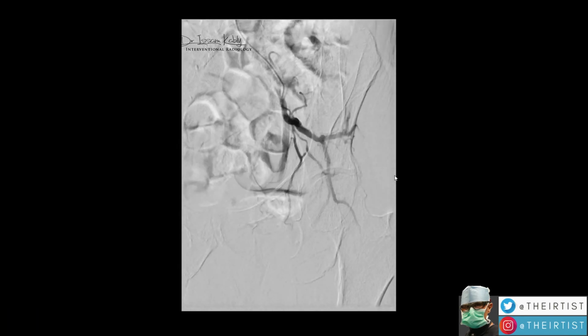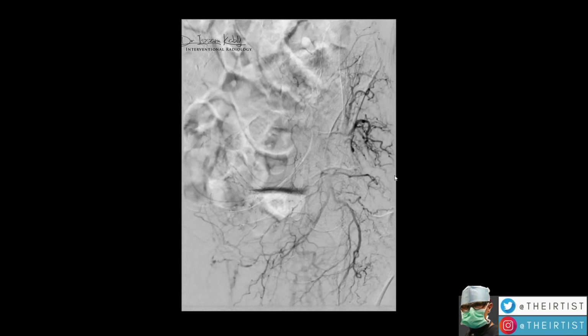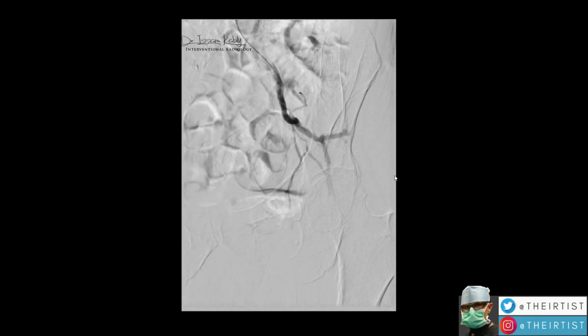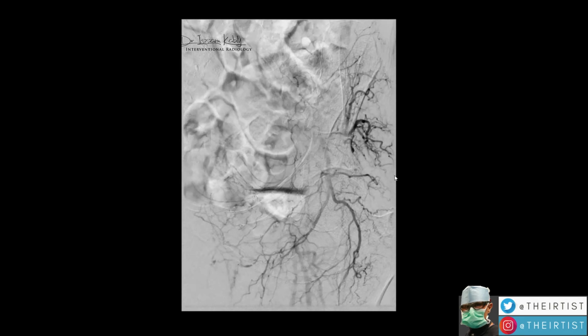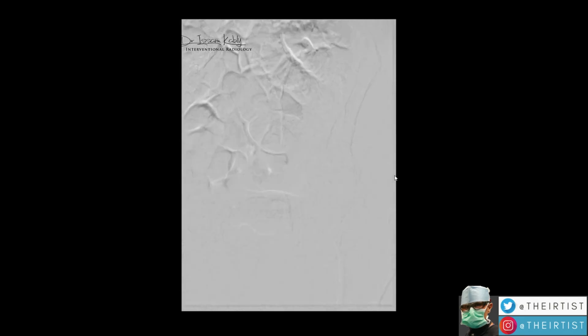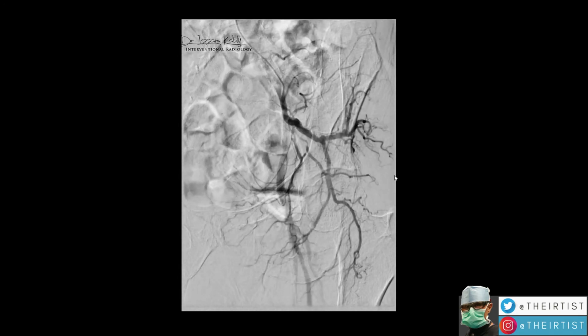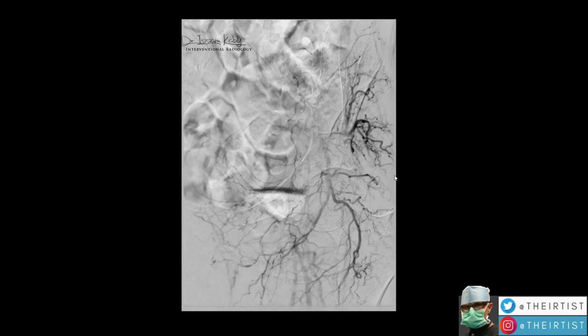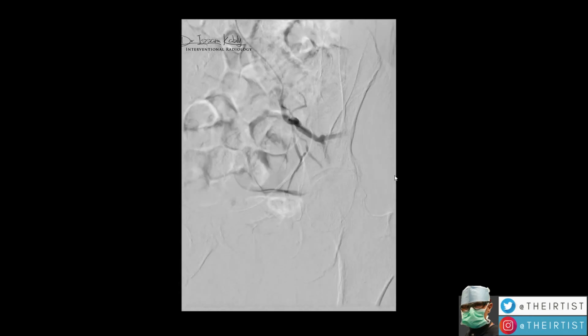So this is one of the limitations of PAE, and I think the only limitation, in my humble opinion, is the patient's own vessels. We need arteries to perform PAE. If the patient's own vessels are occluded due to plaques because he's a smoker, he has atherosclerosis, etc., this is what limits us. Other than that, I think PAE can be performed in a wide range of patients.